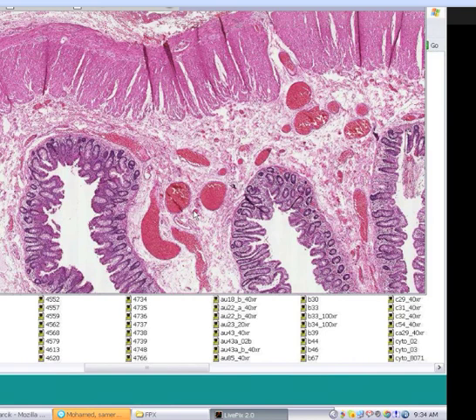And the word dysplasia does not imply pre-malignancy. The word dysplasia just implies an overgrowth of large vessels. And because the blood vessels in any GI organ are the largest and most abundant in the submucosa, this is angiodysplasia of the colon.